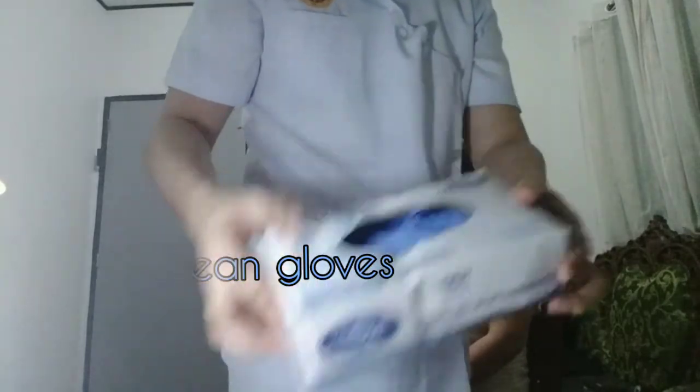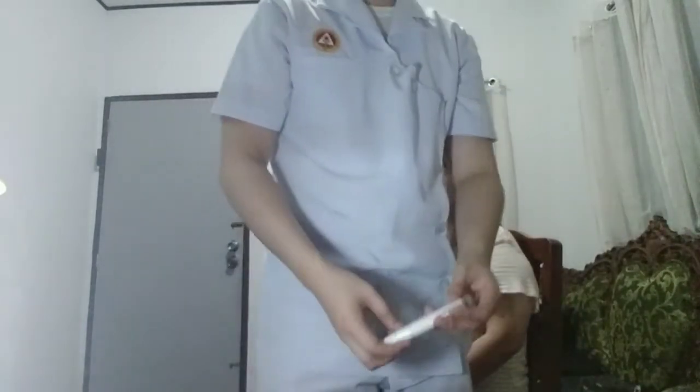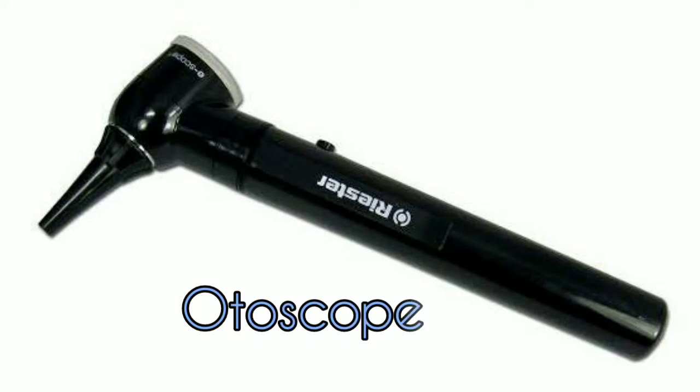The next step is that I'm going to assemble the needed equipment, materials and supplies. So the first is clean gloves, tuning fork, ruler, watch with second hand, and otoscope. But since we don't have any otoscope right now, I'm going to use a penlight. An otoscope, also known as an auriscope, is a medical device which is used to look into the ears. I've already worn my clean examination gloves, so now we're going to proceed in the assessment.